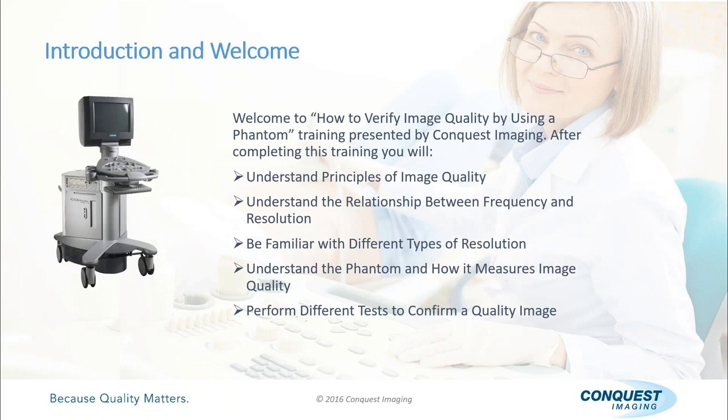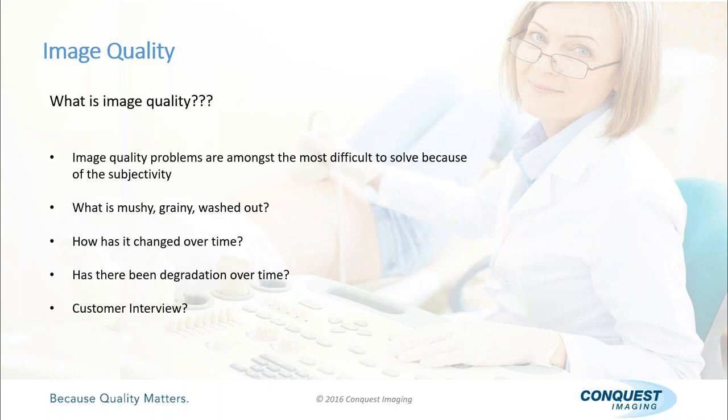All right. So now we'll get started. So what is image quality? Why is it important? Image quality is really funny in ultrasound. How many here work directly with ultrasound? Anybody? When you encounter a problem and they're trying to describe it, they use really definitive words like mushy. Well, what's mushy mean, right? You're trying to put a word to something and, well, it's broke. Well, thanks, it's broke. But what do you mean by broke? Well, the image is mushy. That doesn't help us very much.